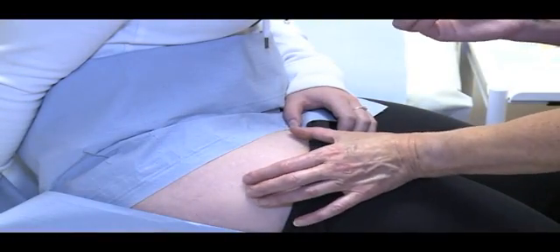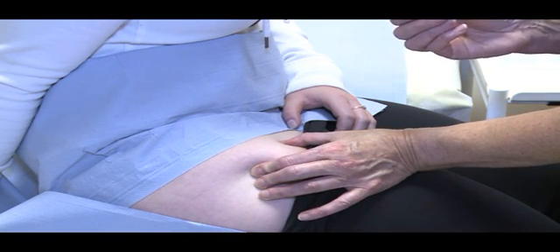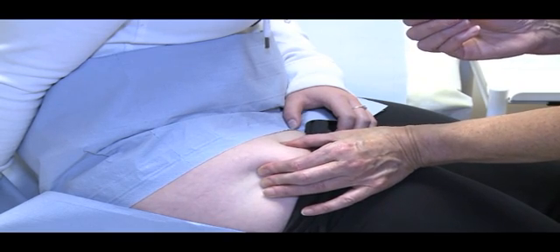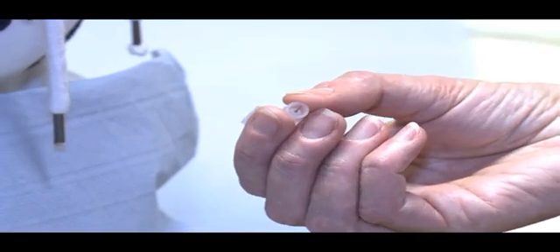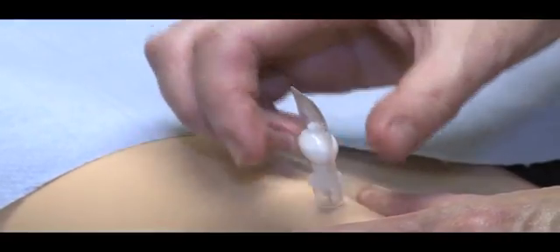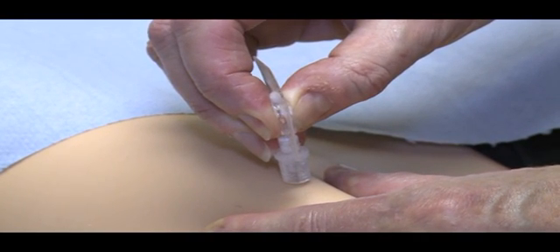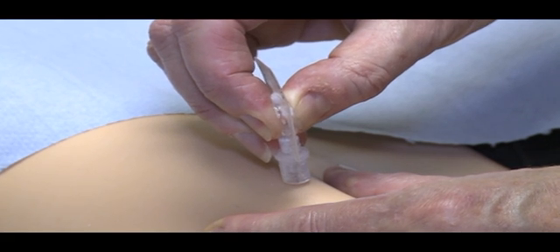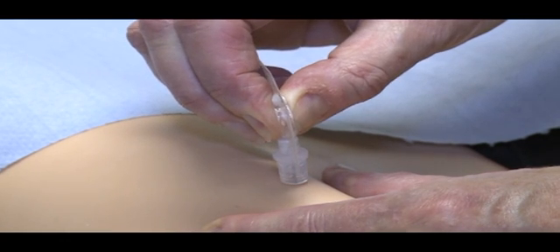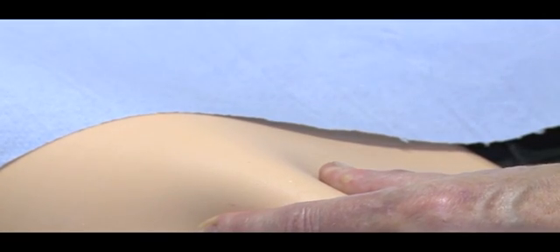To give the injection, gently grasp and squeeze a large area of skin in the chosen area between the thumb and forefinger, pulling it away from the body. Hold the injector by the port and keep it as vertical as possible. Now insert the needle into the skin so that the needle tip is in the subcutaneous tissue and the port just touches the skin. Holding the reservoir firmly between thumb and forefinger, squeeze the reservoir slowly to inject the medicine. This should take about five to seven seconds. After the dose has been completely injected and the reservoir has collapsed, gently pull the needle out of the skin.